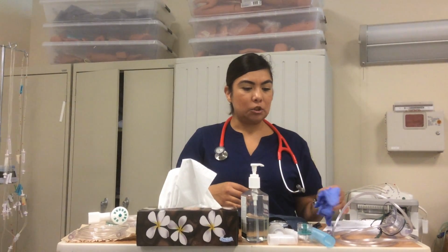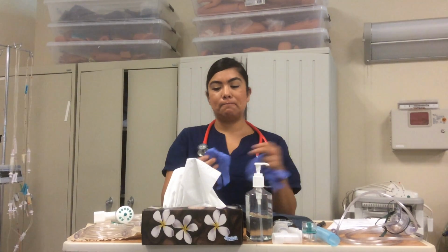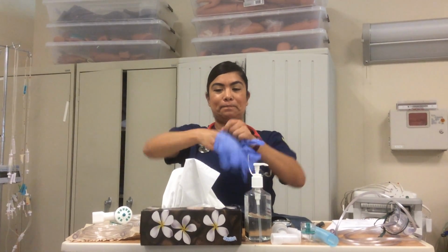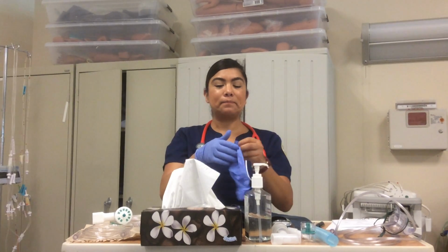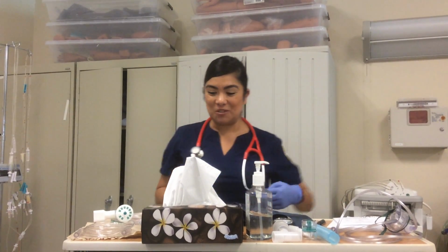And then I'm just going to go ahead and put 3 mLs of hand sanitizer. Now you want to wash your hands if there's a sink. If there's not, then you just grab some 3 mLs of hand sanitizer. You're going to rub for 15 to 20 seconds, or until it's completely dry. Okay, I'm going to grab my gloves. Knock before I go into the patient's room.